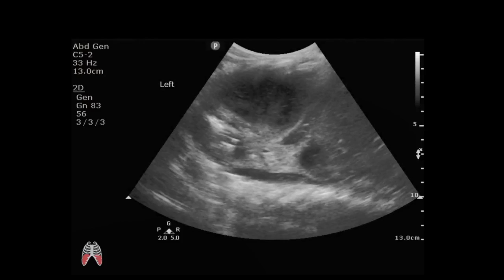Hepatization, right, and then I heard pleural effusion somewhere, right? So the idea is that these are 4 entities. So loculated, excellent. The fact that you're even seeing any of this tells you that there's definitely pathology in that thorax. But even this is going to be a whiteout on that x-ray, and once you have a whiteout on the x-ray, you have no idea what that means. It could be fluid, it could be consolidation, it could be anything, right?